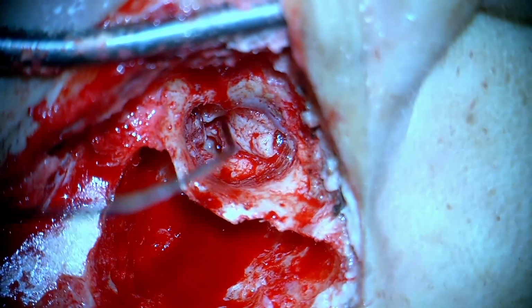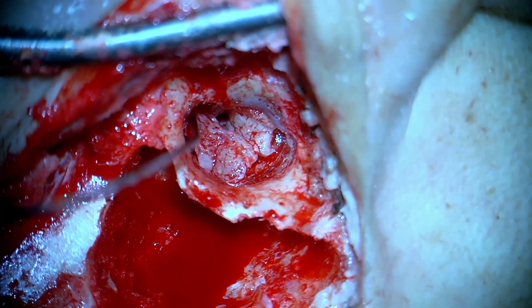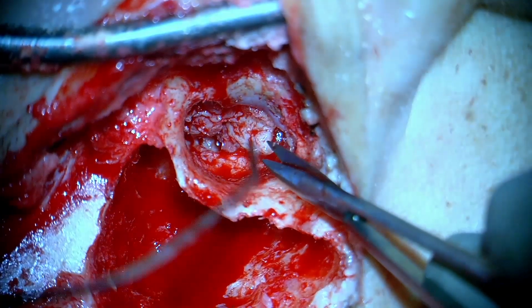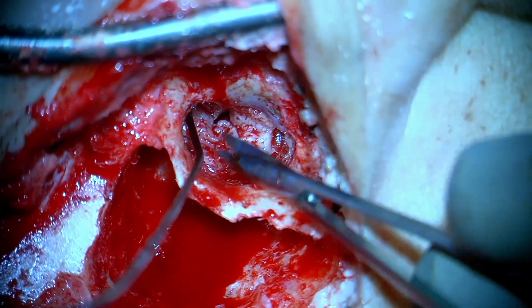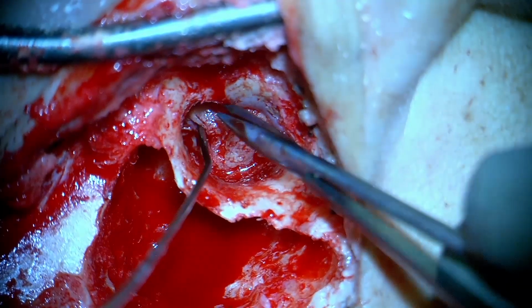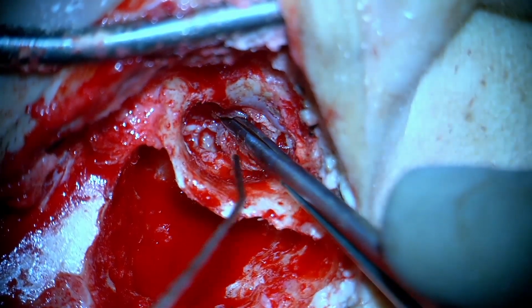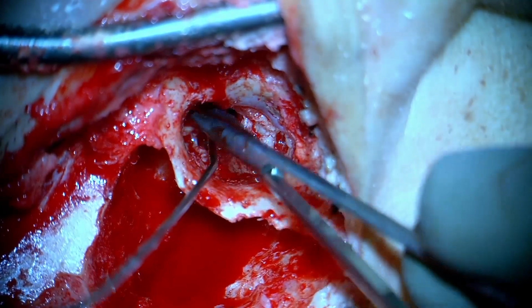It can't be overstated how important it is to completely clear the diseased mucosa, because that can often have biofilms and chronic infections with these patients and often jeopardize the graft healing outcomes. And normally we always prefer using a sharp dissection here.